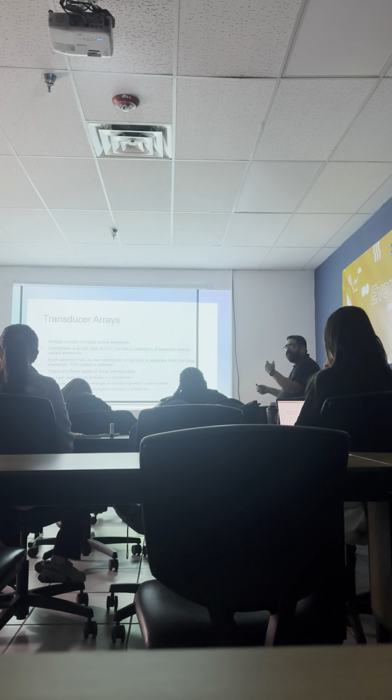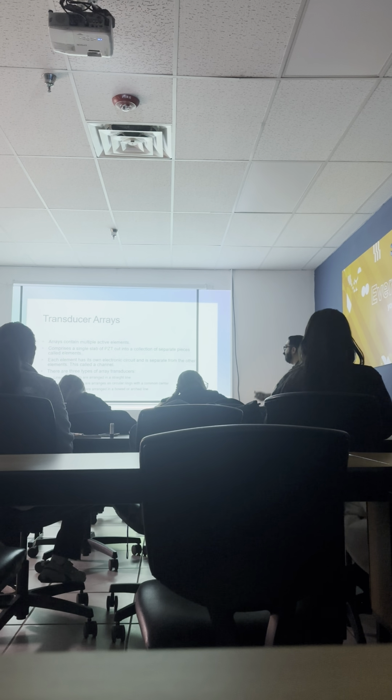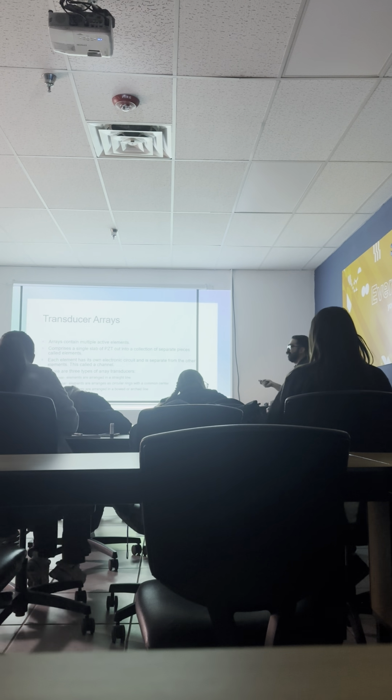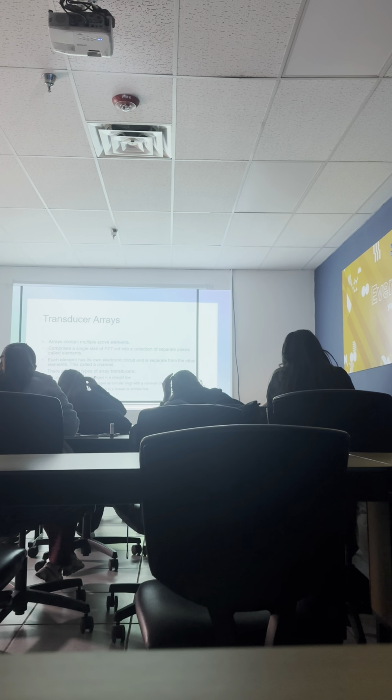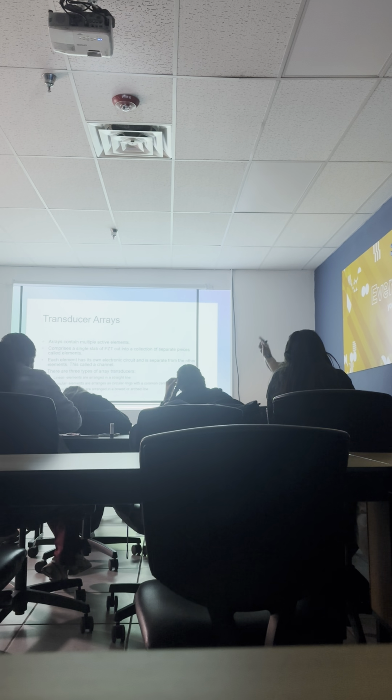Okay, so annular, right? A circle. Anillo. The elements are arranged as circular rings with a common center. They have one solid disc in the middle, and rings around that solid disc that change in size from the inside to the outside.